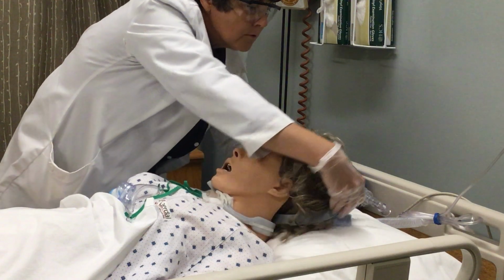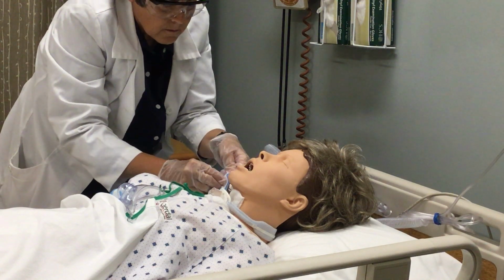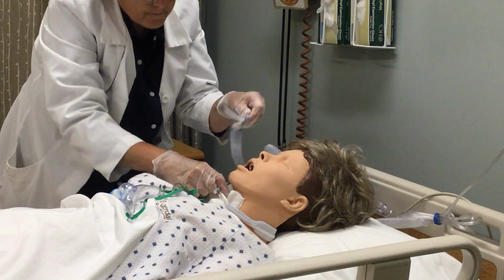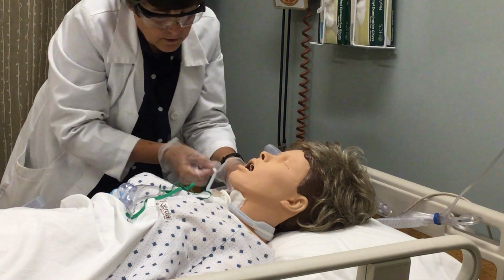Take Miss Cruiser's old one off. Dispose of the old one, and I want to make sure that her new one is on securely.